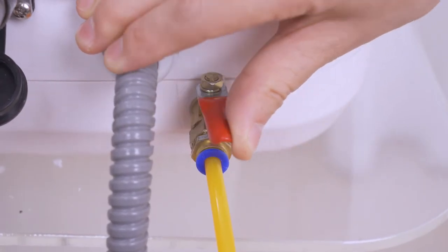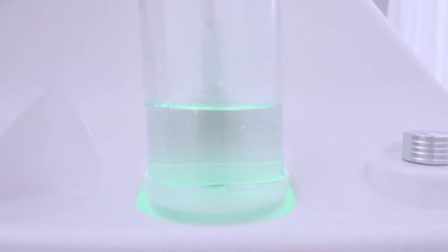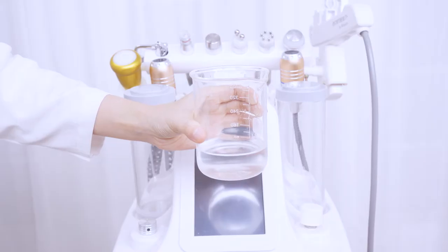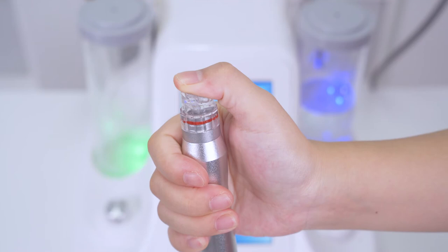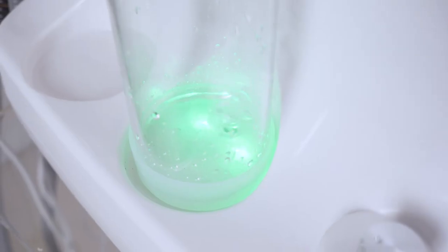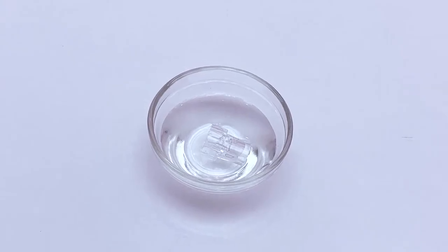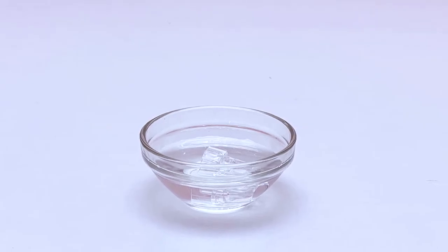After the treatment, empty the waste bottle and turn on the red valve to pass out the waste water. Fill the clean water bottle with normal saline after each treatment. Turn on the device and block the handle with your thumb so the normal saline can circulate and clean the device. Soak the tips in 75-degree alcohol to disinfect after each bubble cleaner treatment.